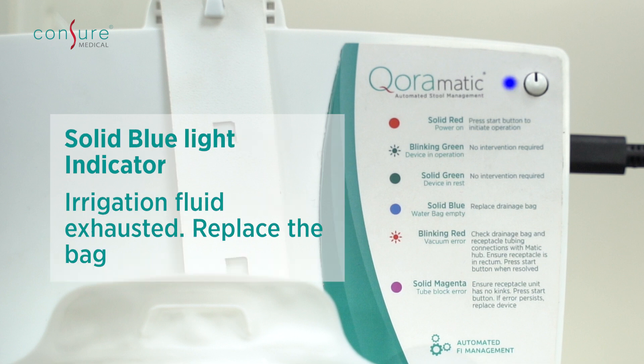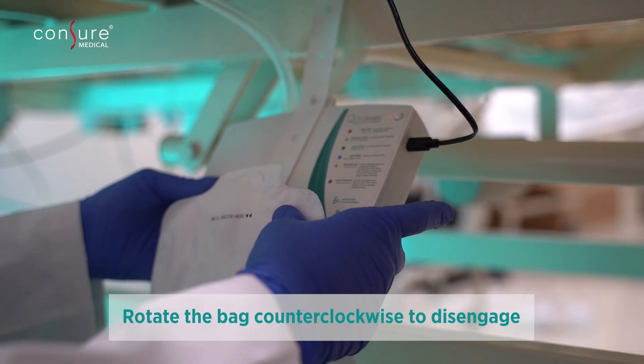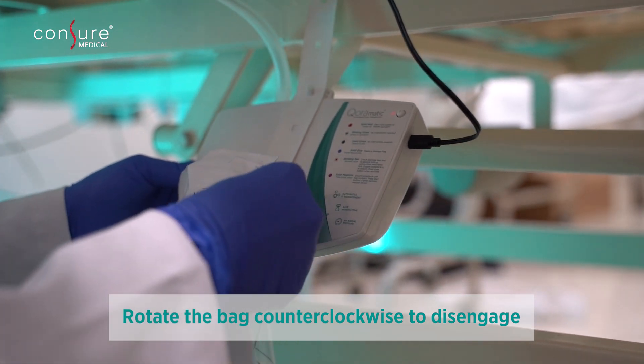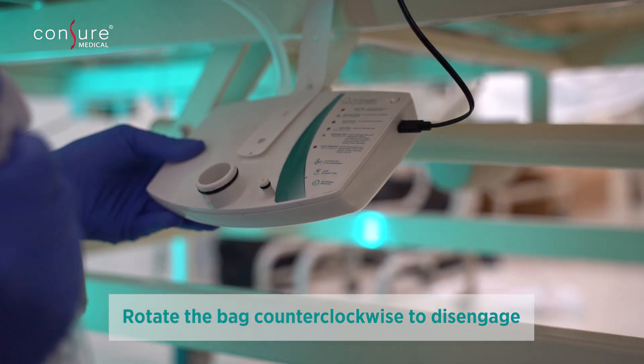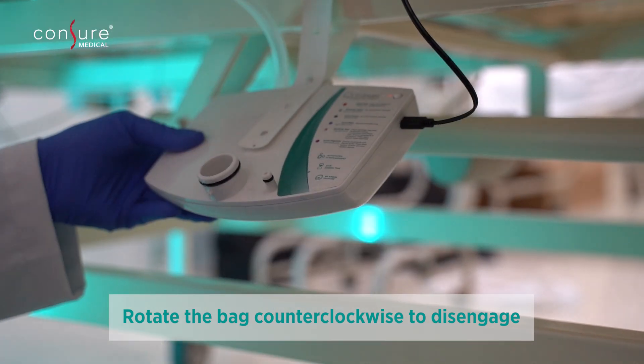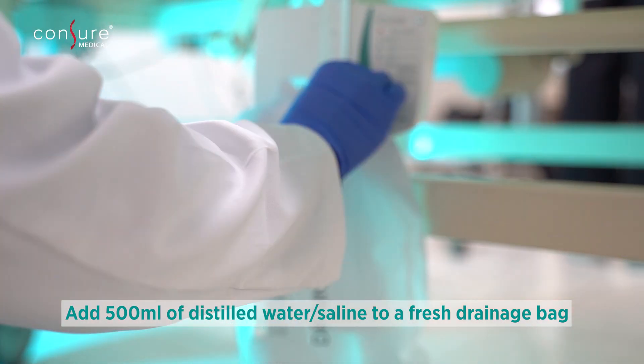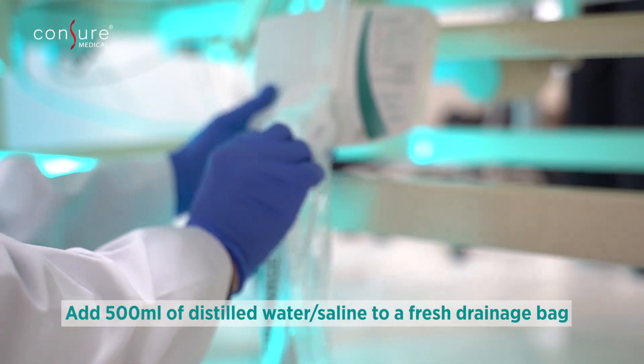Blue light indicates either the irrigation fluid is exhausted or the drainage bag irrigation connector has disengaged from the irrigation port. To disengage the bag, tilt the Matic Hub upward to avoid spillage and rotate the drainage bag counterclockwise. Discard the used bag according to institutional protocol. Make a fresh drainage bag filled with saline and rotate the bag clockwise until locked properly with the Matic Hub.